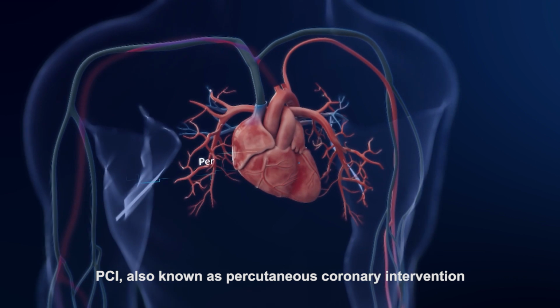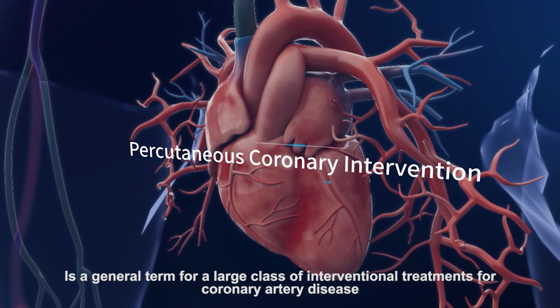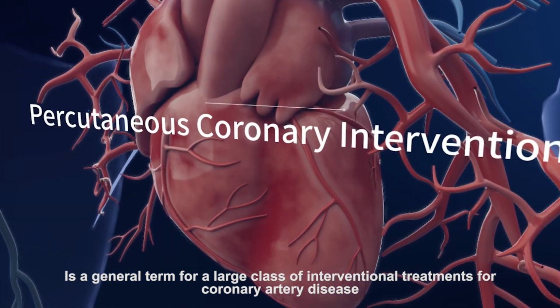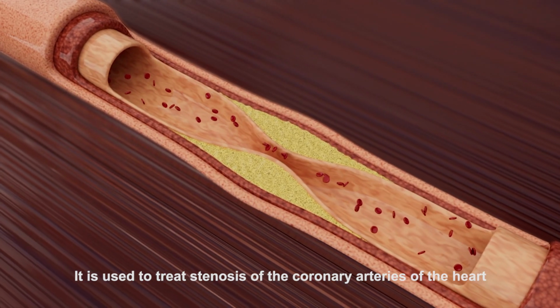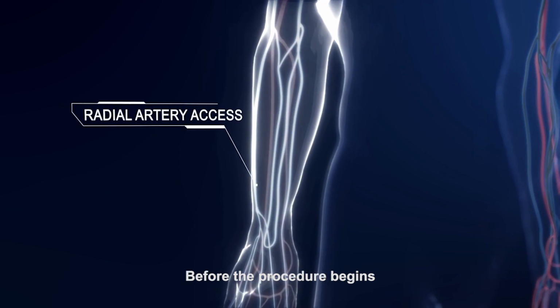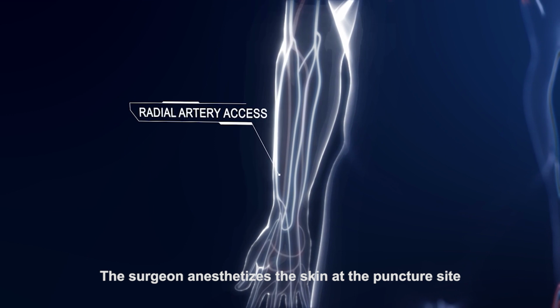PCI, also known as percutaneous coronary intervention, is a general term for a large class of interventional treatments for coronary artery disease. It is used to treat stenosis of the coronary arteries of the heart and to restore blood supply to the vessels. Before the procedure begins, the surgeon anesthetizes the skin at the puncture site.